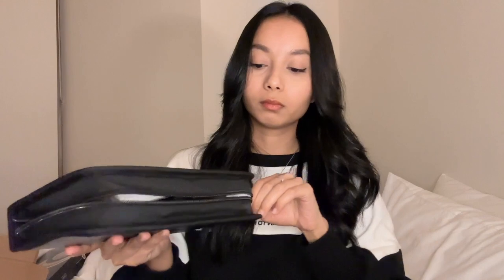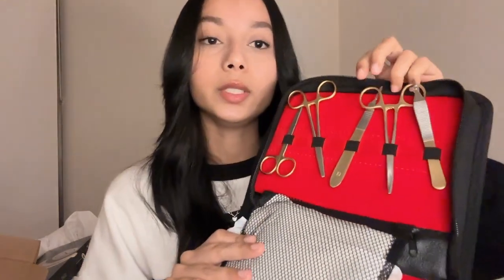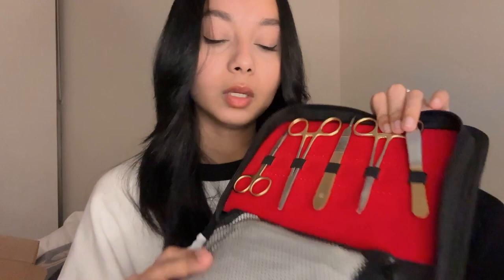I intend to do as much suturing practice as I can in my free time — making it into muscle memory while watching a Netflix show. So I just opened it. I ordered this from Amazon; it's called Medical Pro. Here's the kit — they've given us scalpels and surgical blades, many of them. We've also got forceps, needle holders, scissors — everything you need to practice suturing. And then there's also this pouch.